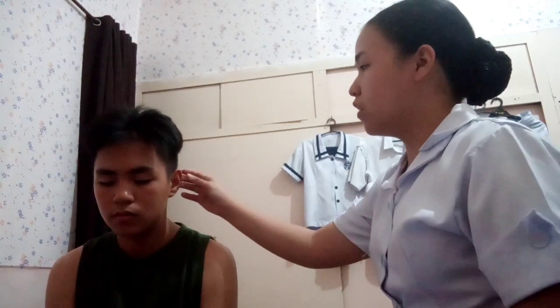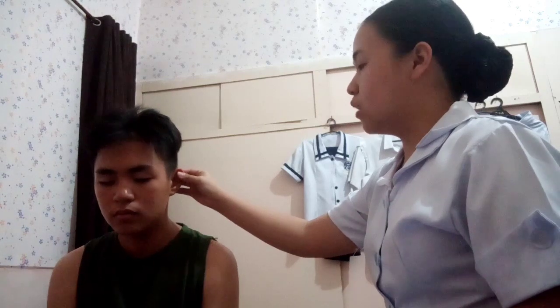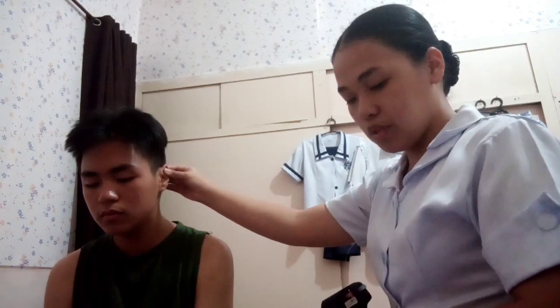And then I'm going to proceed on inspecting the internal ear structure. So, inspecting the internal ear structure, I am going to use the otoscope. So I'm going to start with inspecting the external auditory canal or the ear canal using the otoscope. So I'm going to do this action. I'm going to hold the auricle, pull it out and back. Then I'm going to use the otoscope to inspect it.